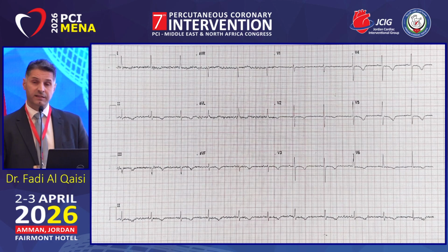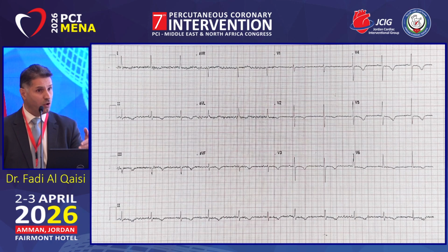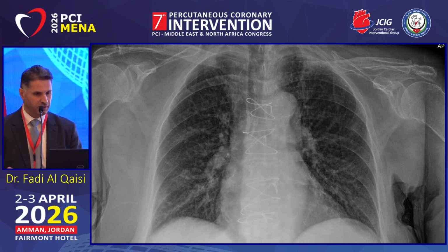You can appreciate in her ECG the ischemic changes. We'll come back to this later. You can see the T-wave inversions indicating ongoing ischemia. This is her chest X-ray, and you can appreciate pulmonary edema and fluid overload.